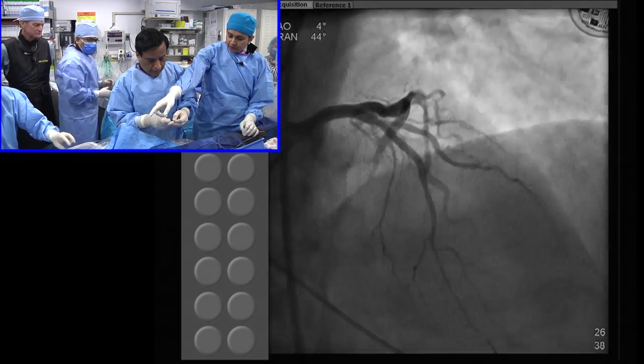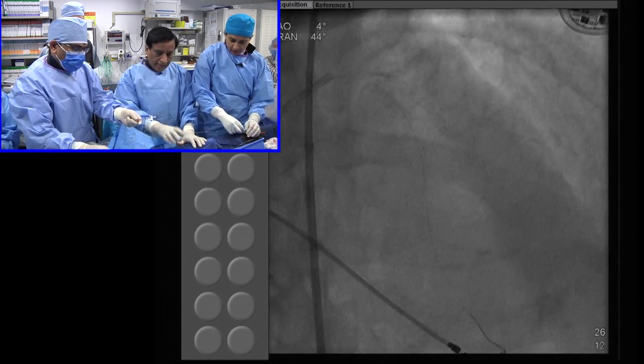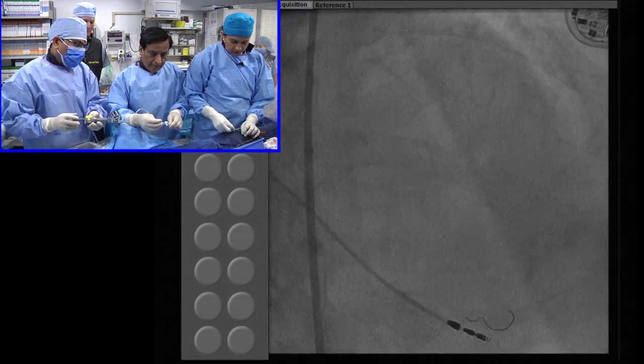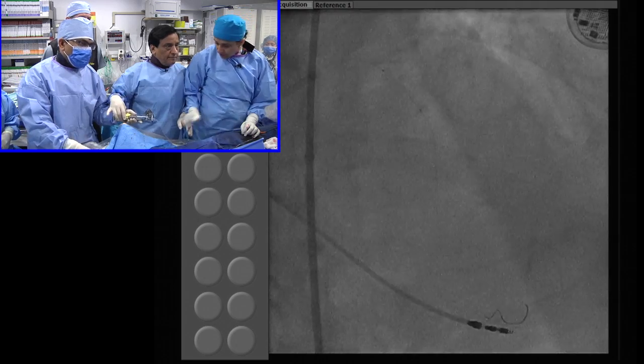Flush it. Proximally you want 3.75, 12 or 8 atmospheres? No, 3.5. I think because remember it's a 3.0, so we go with the 3.5, 12 proximally, or even 8. And that is just before that bifurcation. And we plan to do a final check with OCT. Yes. Now this is the key.